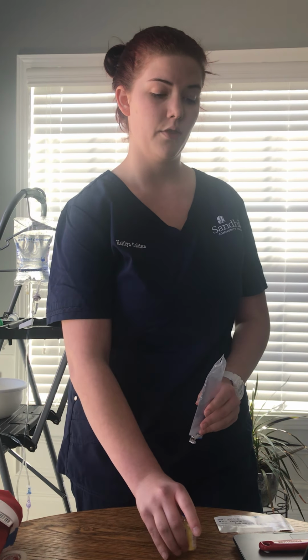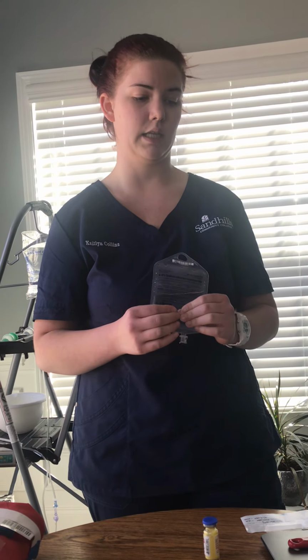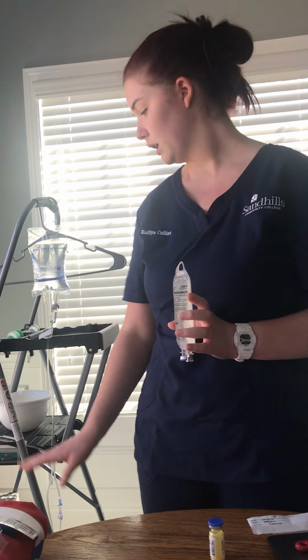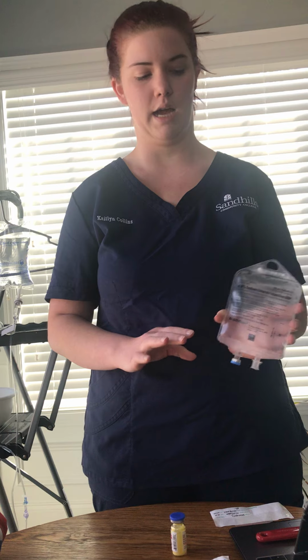All right, so I've calculated the flow rate based on the order, and we'll be giving the antibiotic over 30 minutes because it is a 50 milliliter bag. The drug guide stated that a 50 milliliter bag or a 100 milliliter bag could be used, and it could be given over 30 minutes to 60 minutes. So I will be setting the pump at 100 milliliters an hour because it is 50 milliliters, so 30 minutes, half and half.